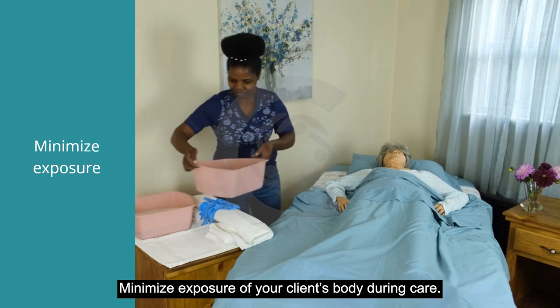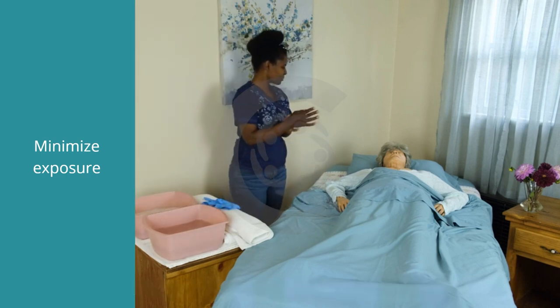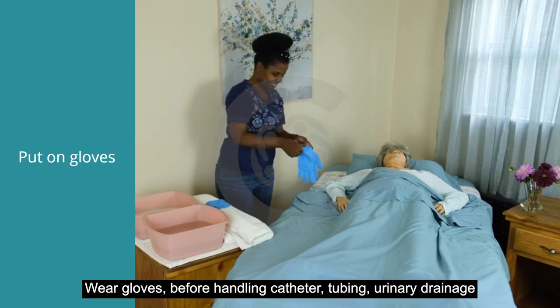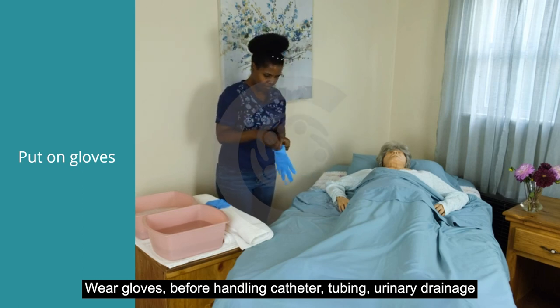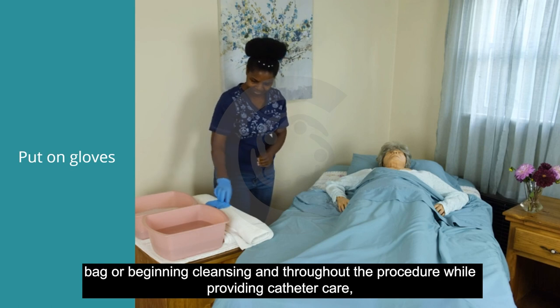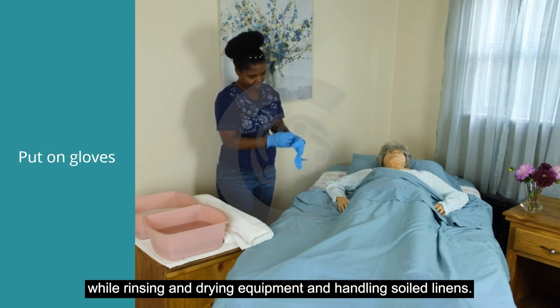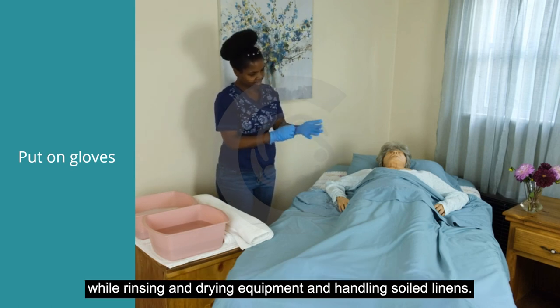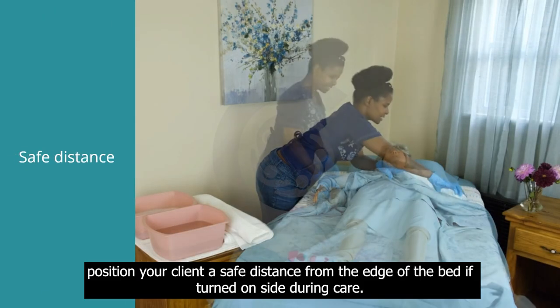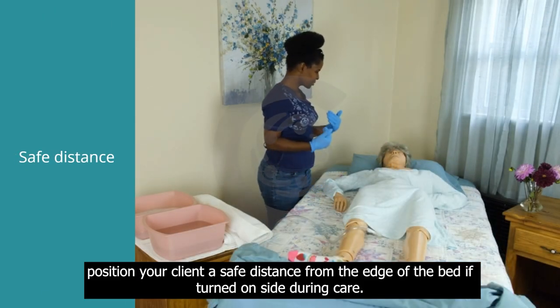Minimize exposure of your client's body during care. Wear gloves before handling the catheter, tubing, or urinary drainage bag, and throughout the procedure while providing catheter care, while rinsing and drying equipment, and while handling soiled linens. Position your client a safe distance from the edge of the bed if turned on their side during care.